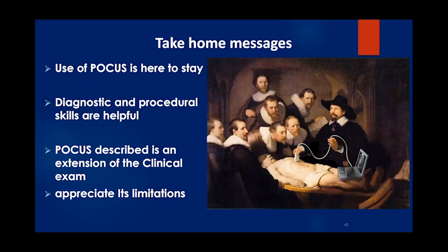Now for UVCs, which I think is more important, commonly people just look at the IVC and see it there. But this will probably just show you the line. It will not show you the tip of the line. Our aim is to assess if it's intracardiac or not. So starting from the most intracardiac part, if you go to a parasternal long axis and look at the inflow, just like the image I showed, you might see it there. If you do parasternal short axis, focusing on the aortic level, you will see part of the right atrium. And you will also see the PFO or the ASD, and you might see the line passing from the right atrium into the left atrium if it's quite deep. Sometimes you can see it in the subcostal short axis. So the message that I want to convey is that one view is not enough to see the UVC.